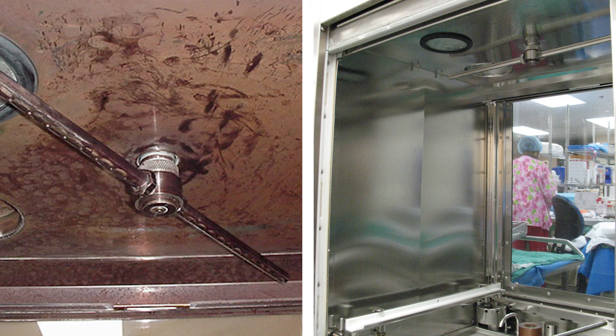Here's an image of a washer disinfector from the state of Florida, a state known for its difficult water quality for instrument processing. The image on the left shows the top of the washer disinfector chamber — you can see how discolored these are. The image on the right shows the same equipment after switching to Prolistica.